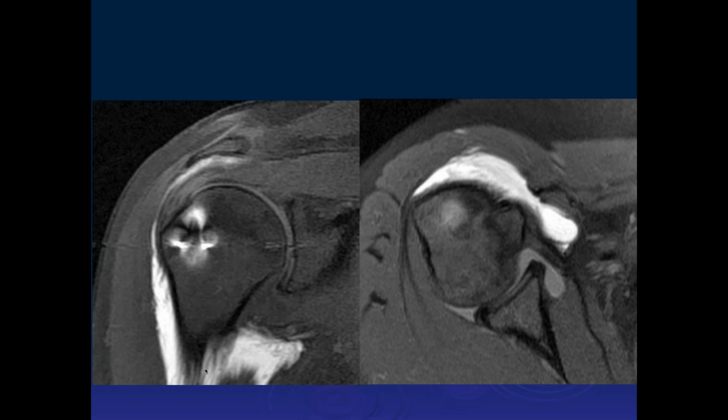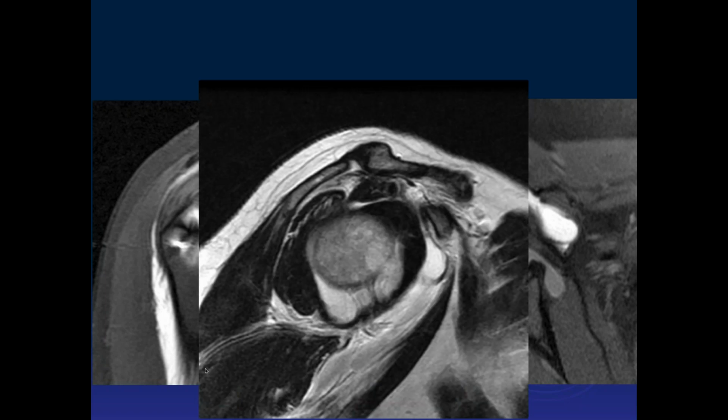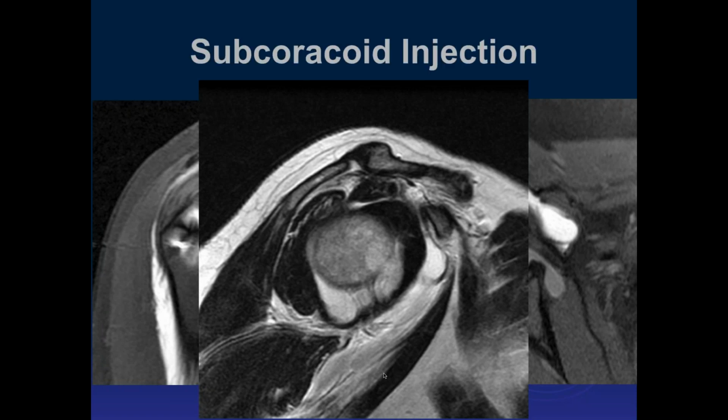I got it. And then here we can see this is all contrast down through here inferiorly, right where you were concerned about. Yeah, that's a peculiar injection. Yeah, we hope not to see too many of these.